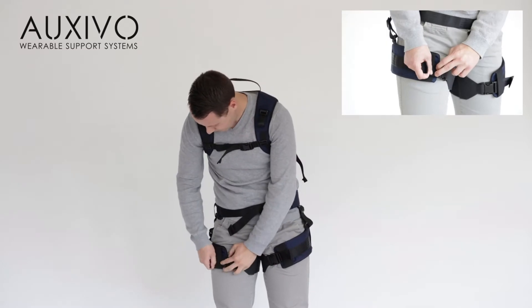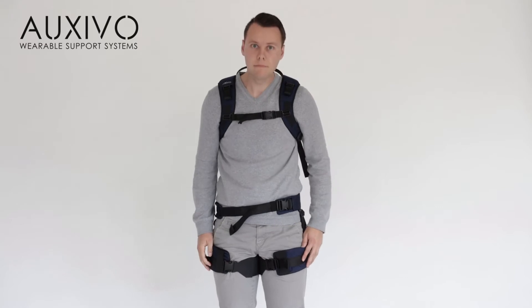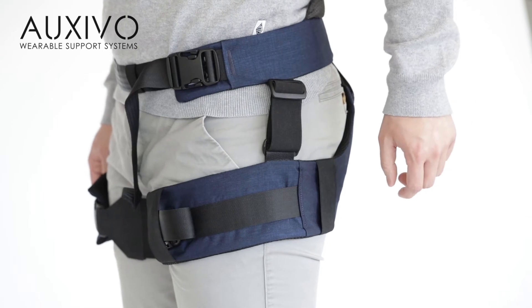You might have to re-adjust the lift suit fittings a little after you have started using it to achieve optimal fit and comfort. Next, adjust the bands at the side of your hip. This will prevent the cuffs from slipping down your thigh.